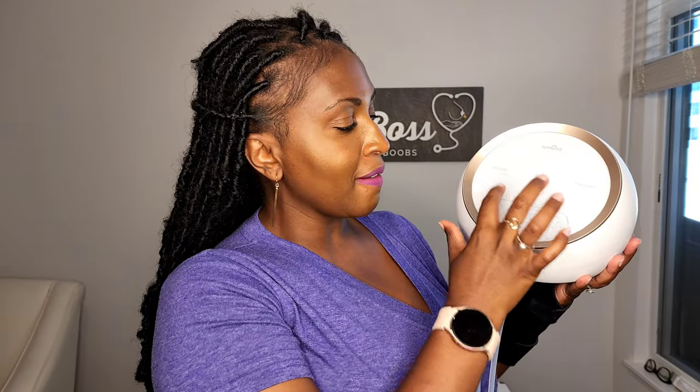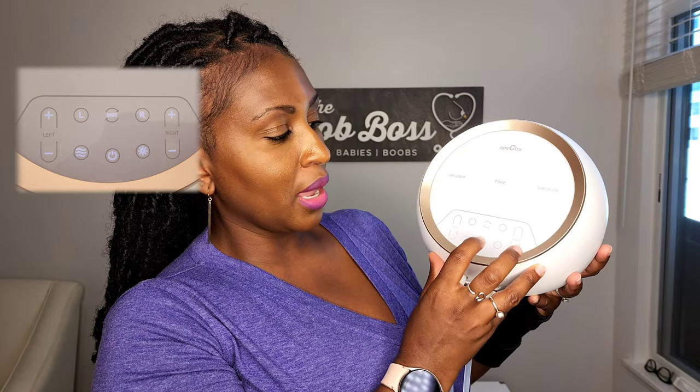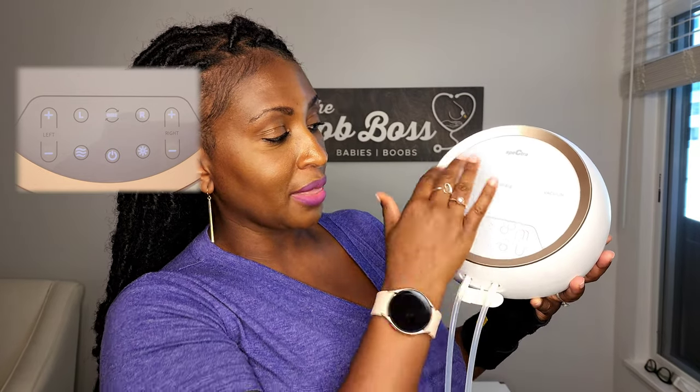You've got your vacuum on either side, left and right, and then you've got your cycle. I'm going to go ahead and turn it on, and if I push left, that will turn on the left side. The right side is still off, so I can pump just one side on the other side without having to close the port.